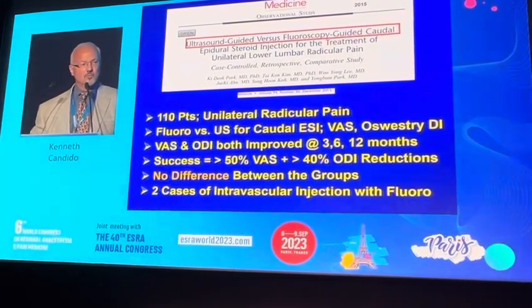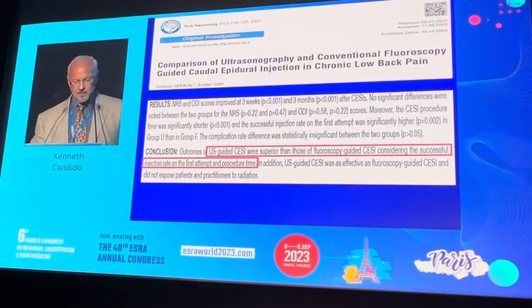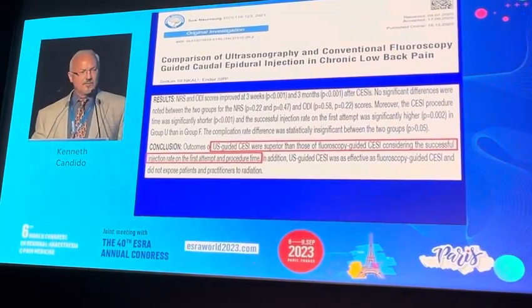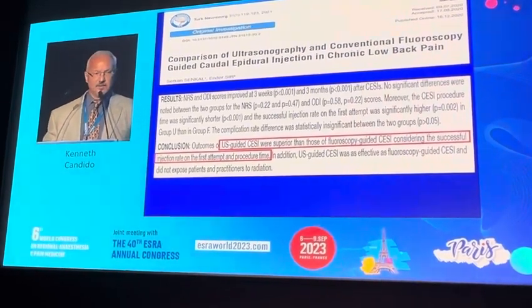Take your pick. Whatever you're more comfortable with, whatever you're more competent in, that's what you ought to be doing. A more recent study that was published in the Turkish literature, however, suggested that it was faster to do a caudal injection using ultrasound guidance. I would respectfully disagree with this.